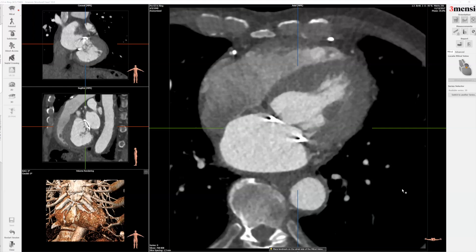Hello, today I'm going to show you the Freemansio pre-CT workup on a patient with a previous mitral annuloplasty ring being evaluated for transcatheter mitral valve-in-ring replacement. Here's the workup.